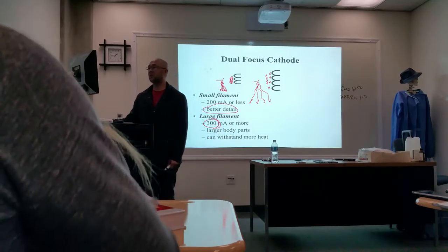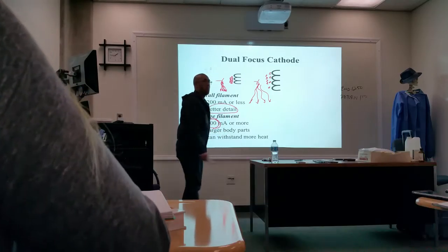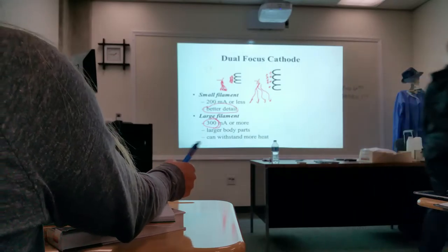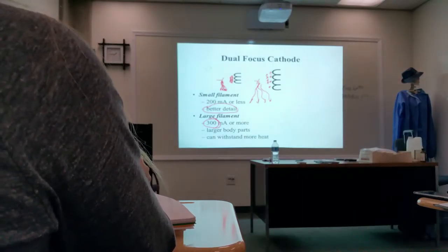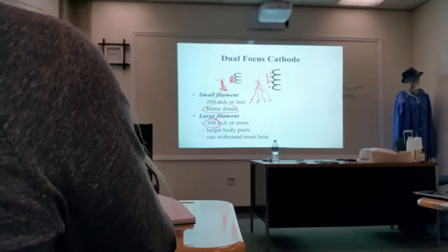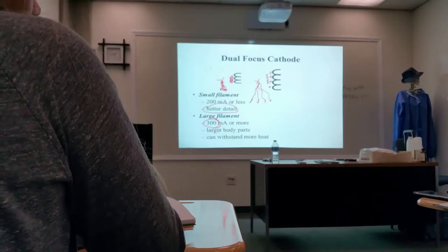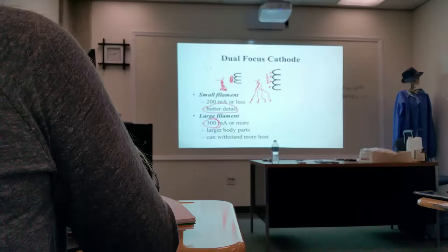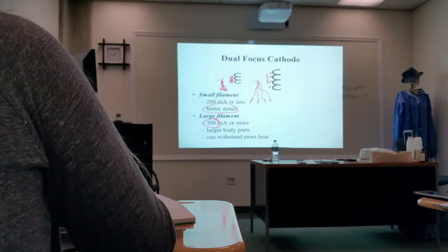Any questions? So can we use a few of the smaller ones and put them together? Say again, one more time. For the bigger project? How about you can use the smaller filament a few times for the larger one? If we want to have a better detail, okay, I'm going to get to that later on. So the question is, how are we going to get better detail? We're going to talk about it in the line focus principle, okay?